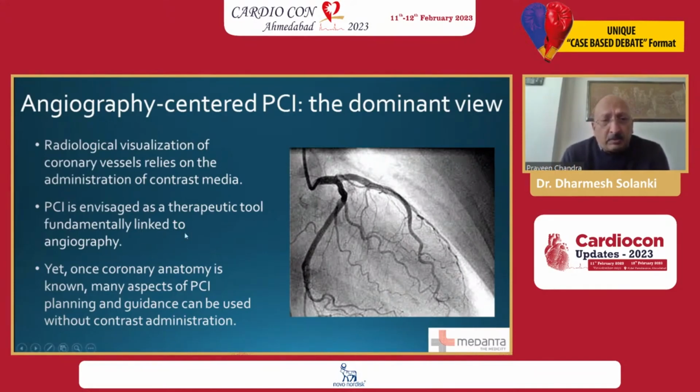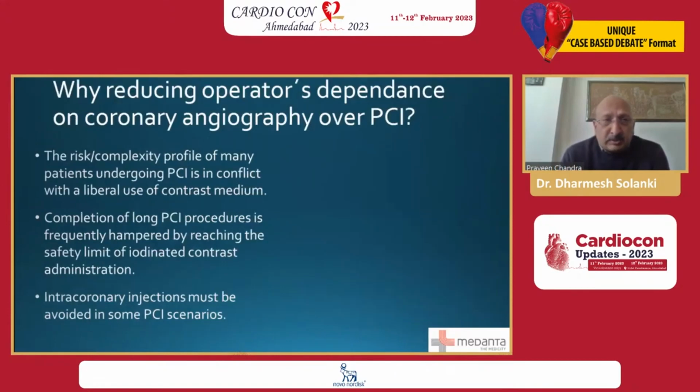And then we do it all through the guidance of these imaging tools without contrast administration. And basically, this helps us in treating very complex patients, high-risk patients, and the liberal use of contrast medium, which we used to do in angioplasty, is completely minimized.